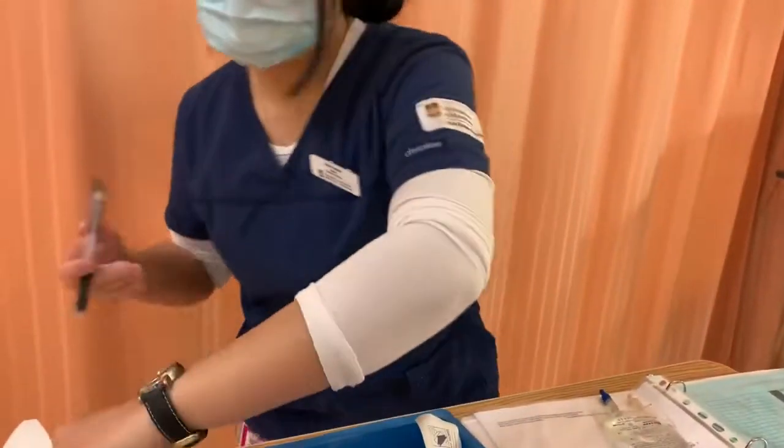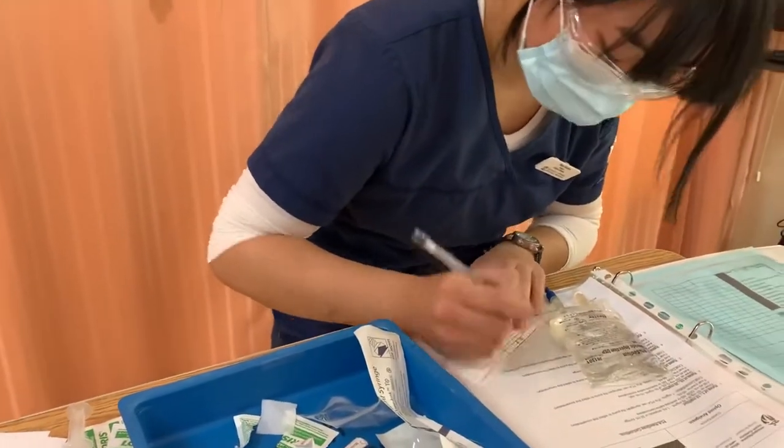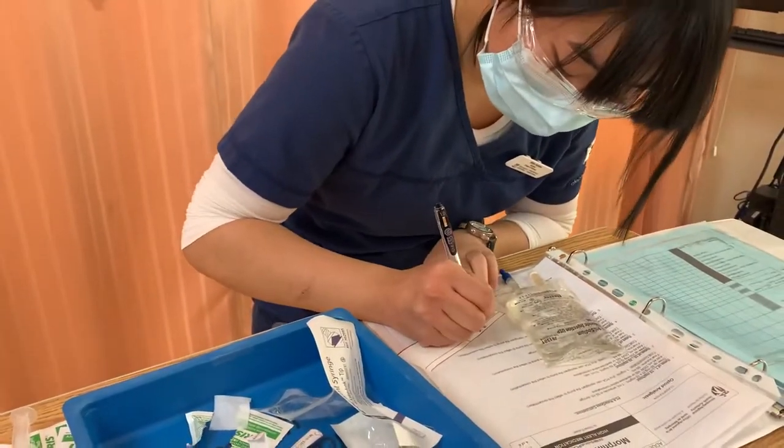So now I'm just gonna do the labels for this one. So our patient is Marcy Paris, and the drug name is morphine.